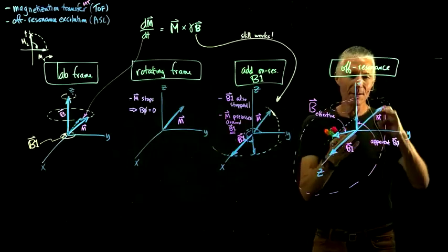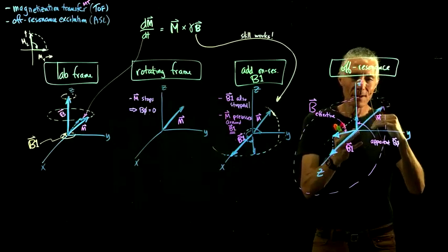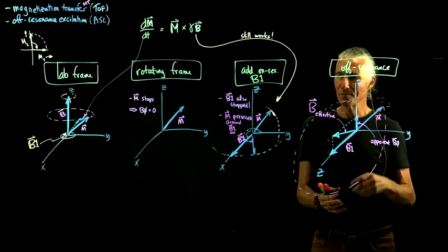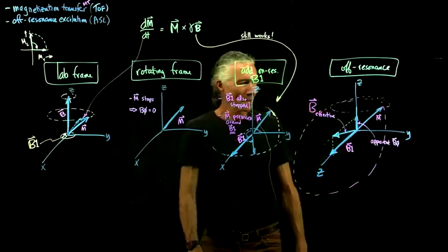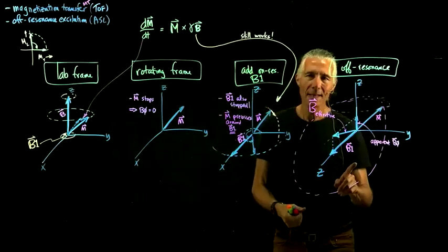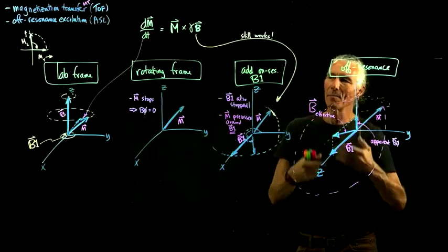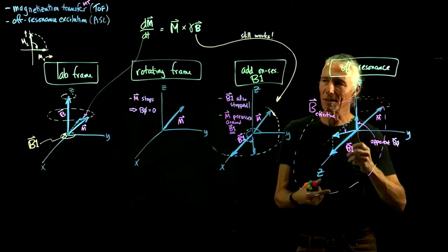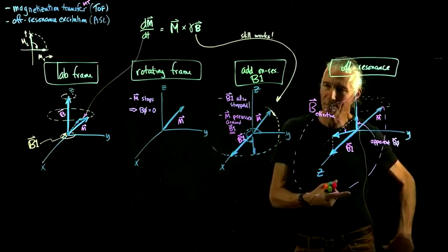And what does that mean? We're going to predict what the flip angle is going to be, and what the phase is. What is the actual phase of the oscillation? When we get back to arterial spin labeling, we'll see that by slowly sweeping an RF pulse through the center frequency, you can do an inversion. And that's relevant to how arterial spin labeling works.